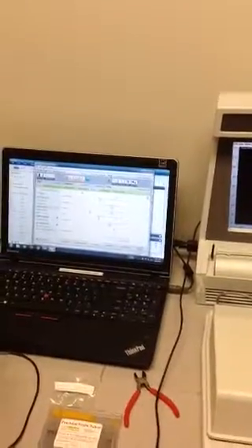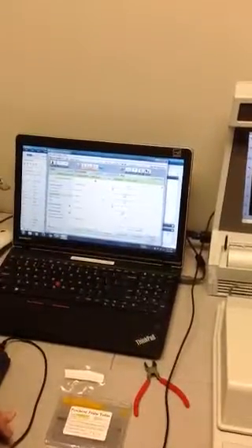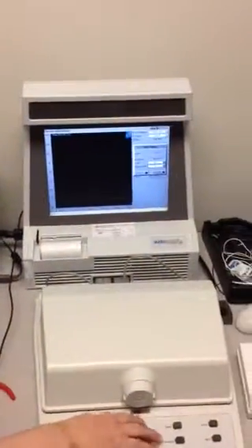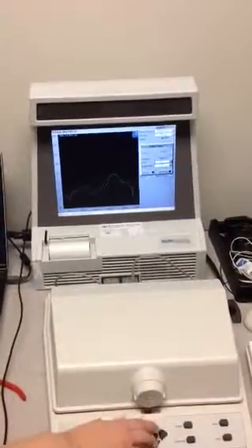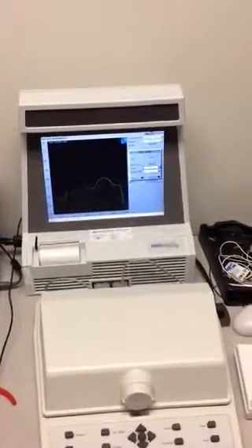Right now, for her current setting, she's in an omnidirectional microphone, but I would like to know what the directional microphone looks like. So I have to force the hearing aid to go to a directional microphone. So I put it in for Phonak into speech and noise, which automatically defaults us to the directional setting. So now I'm going to run the test, and I'm going to put it at average conversation, 60 or 65, with a 6 dB signal to noise ratio.